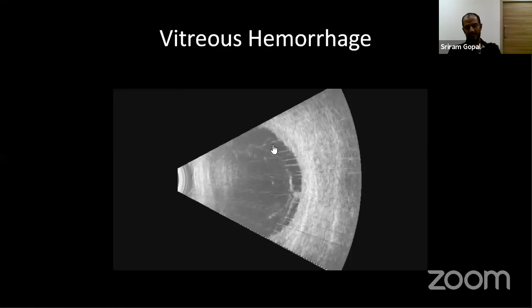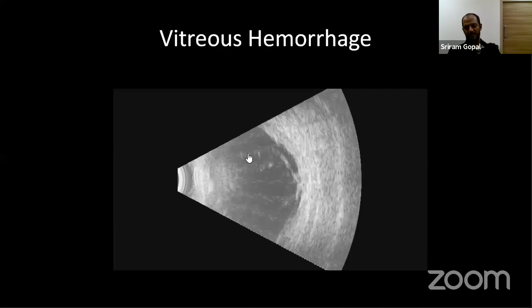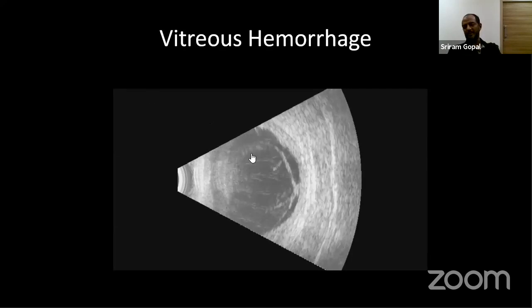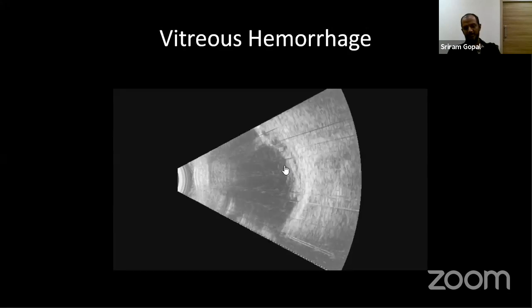posterior vitreous detachment. If you look at the multiple attachments, the retina is attached only to the optic nerve and then to the ora serrata. Once it detaches, it cannot get reattached in any other place. So this is a typical incomplete PVD with multiple attachments, the focal tenting of traction retinal detachment.